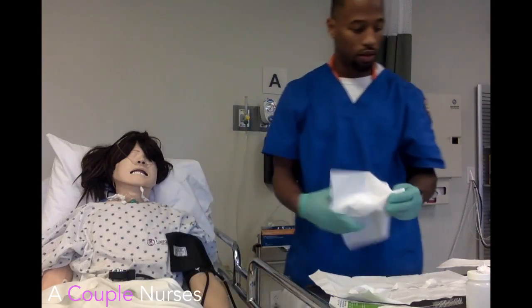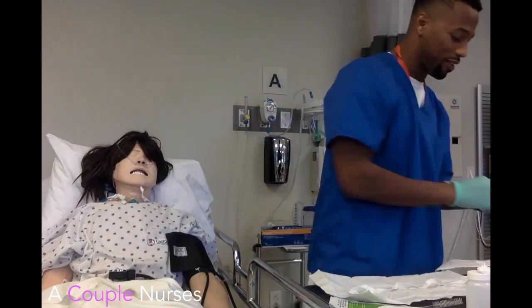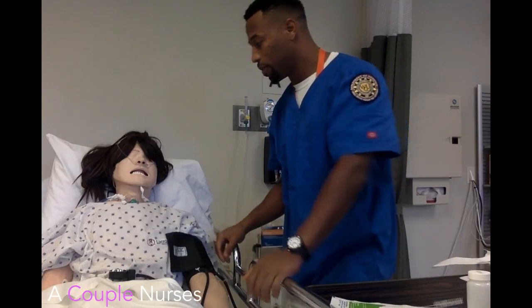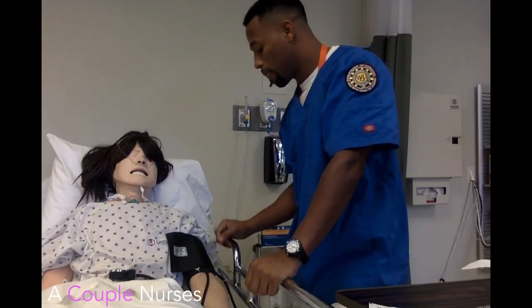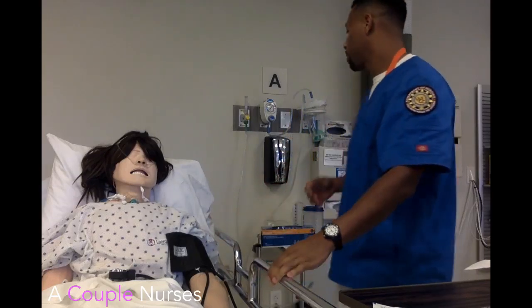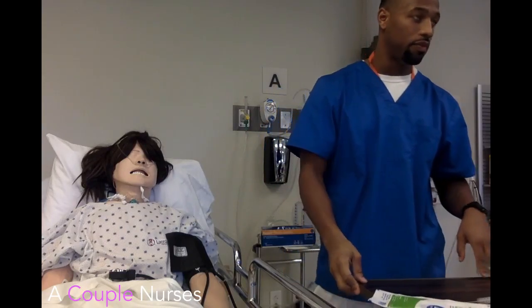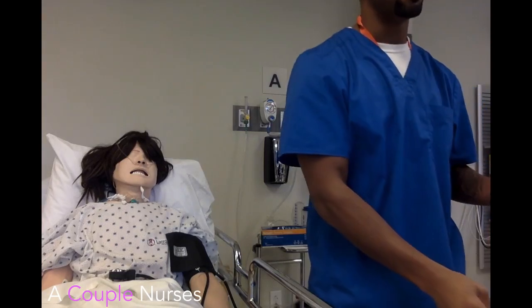Okay, you feeling alright? Any difficulty breathing now? Any chest tightness? Okay, so we're finished up. We're going to check back with you in a little bit to make sure everything's going okay. I would lower the bed, make sure one rail is up to make sure the patient is not confined — sorry, not confined — place the call light, wash my hands, document, and exit.